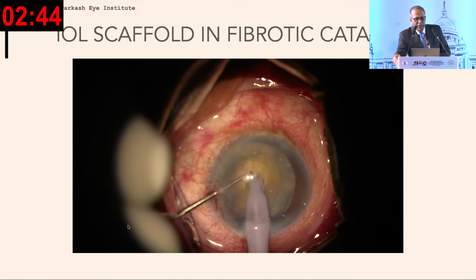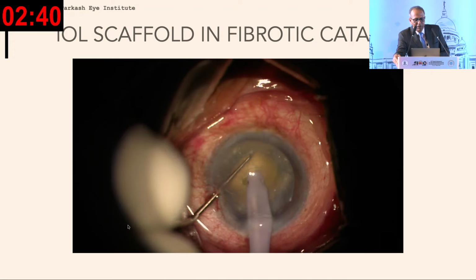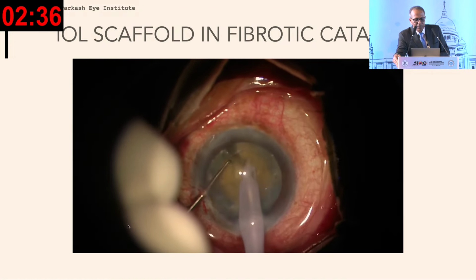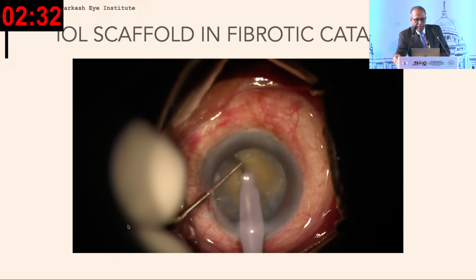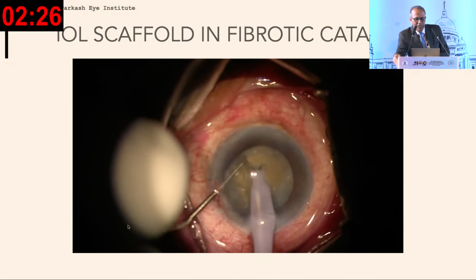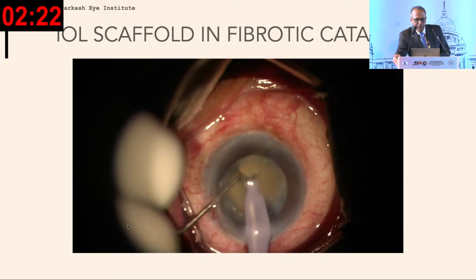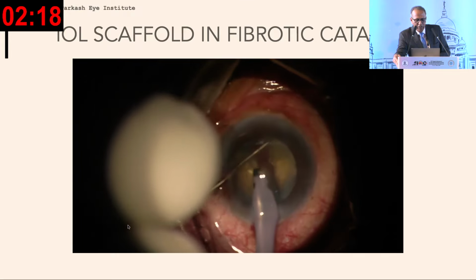After creating an initial trench, the chopping was done the way Dr. Abhay Vasavda has shown, multi-level separation. So it was done to achieve total separation. Then it is in 2x now to save time. Once the chopping was again done, suddenly there is a PCR. Now the idea is, what next?